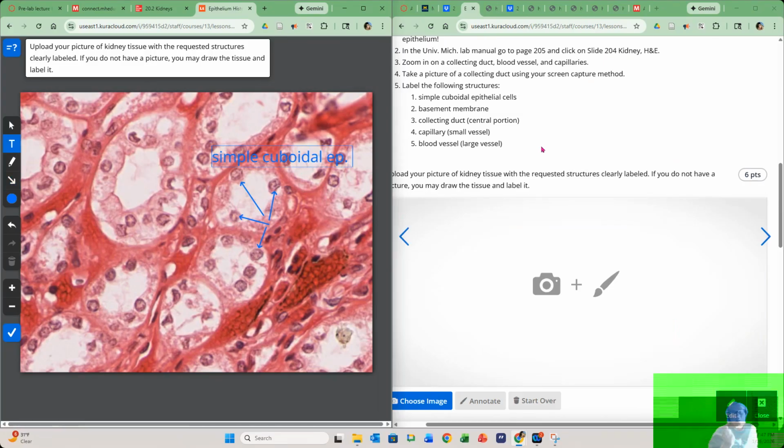Now, if you remember from the pre-lab recording, epithelial tissues are always, always, always supported by a layer of connective tissue. And between the epithelial tissues and that connective tissue, you typically have a little layer of acellular tissue that's made up of those secreted proteins and carbohydrates like proteoglycans that make up the basement membrane. Actually see the basement membrane pretty decently in this image.